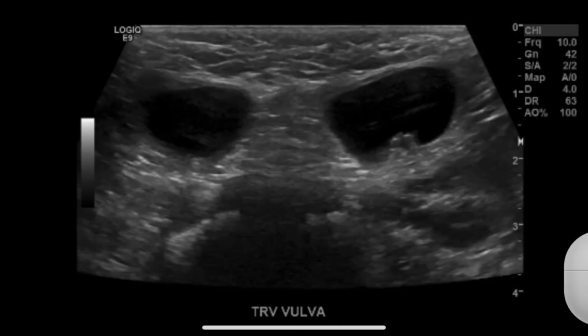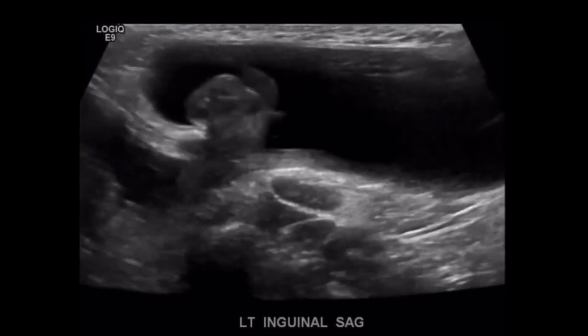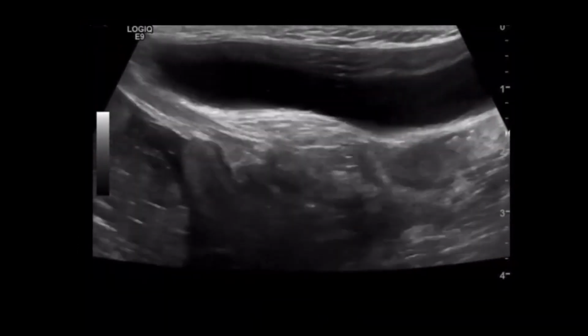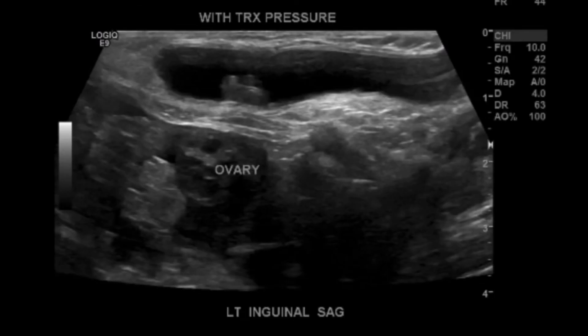And here we have another case with vulvar swelling. So transverse vulva, you can see there's two cystic structures here. These are hydroceles. So similar to what you would see in a scrotum, with Canal of Nuck hernias you can see Canal of Nuck hydroceles. And here you can see with Valsalva, the structures protruding into this hydrocele. That's an ovary on the left inguinal. And with slight pressure, the ovary was able to go back into the peritoneum, although the fluid stayed within the sac, as you can see here on this still with transducer pressure.